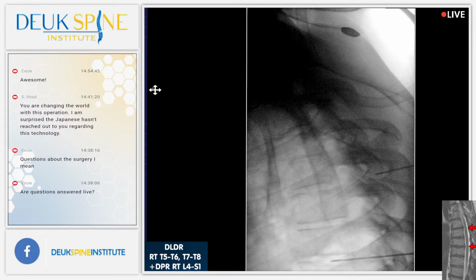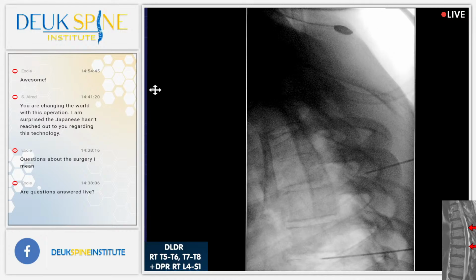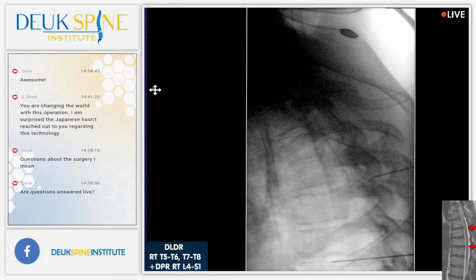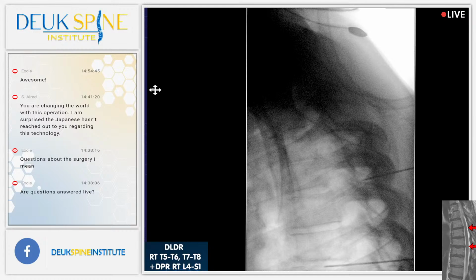Oh, interesting. Shot? You okay? You're doing great. Shot? I'm just having a hard time getting around the facet. See how the facet may be a little bit off? I wonder if we can adjust the orbit, because there seems to be some rotation between 5 and 6. Try the other direction. Try a little bit more. It's hard for me to say. What do you think? No, I agree with you. It is difficult.